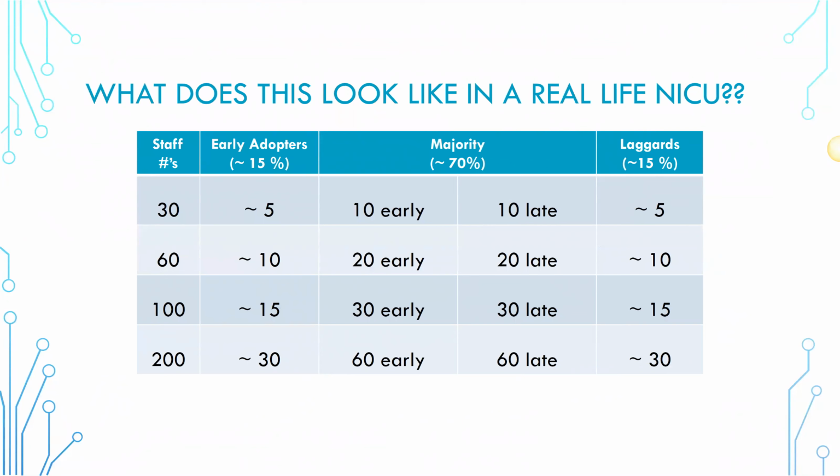We use a tool, and Natus really did come out, actually BrainZ came out with, and then after Natus acquired, they still circulate these little measuring tapes. And these really are the easiest things to use for people like us who are not EEG techs and who don't really know how to put on electrodes, but it's a simple measuring tool, and they come in two sizes, a 35 centimeter or a 25 centimeter size.